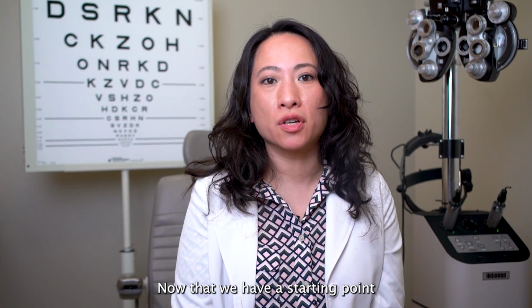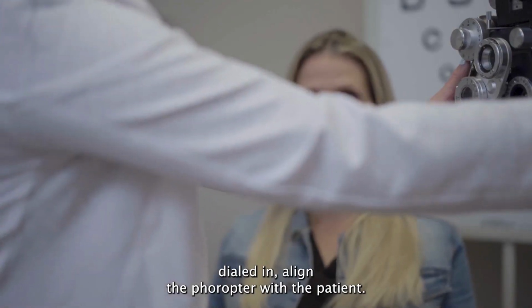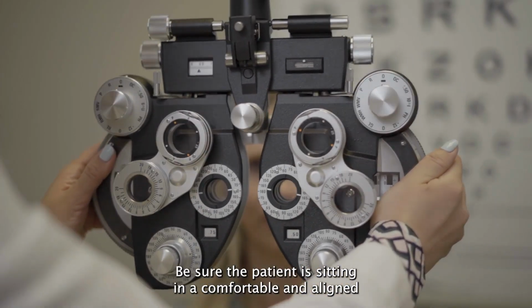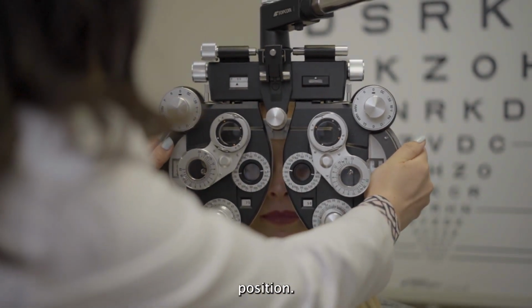Now that we have a starting point dialed in, align the phoropter with the patient. Be sure the patient is sitting in a comfortable and aligned position.